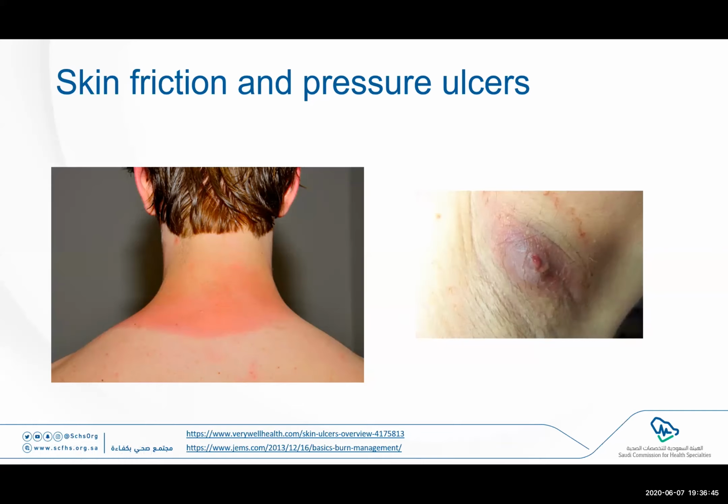And in prolonged application, we recommend that the straps be attached to the bed rails or the side rails instead of under the patient's arms. But we have to be careful that if the patient slides on the bed, you might develop a displacement of the helmet upward, or you might lose the seal. So each position you choose to apply your straps has its advantages and disadvantages. So we have to be careful with that.